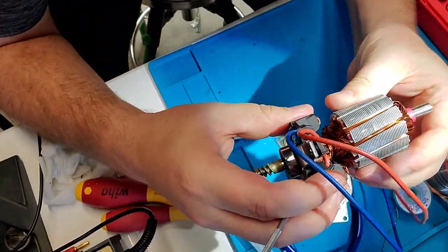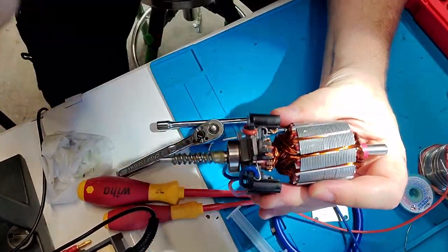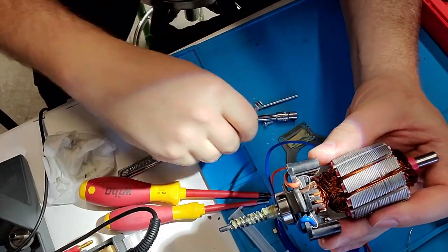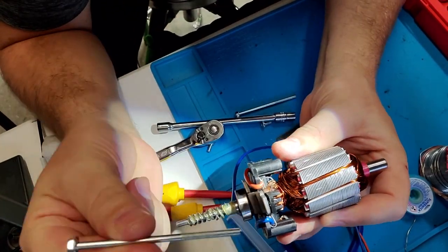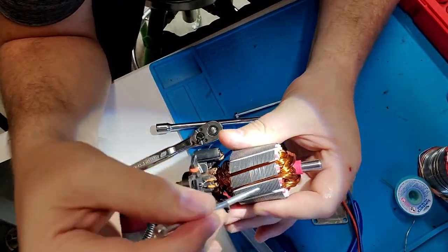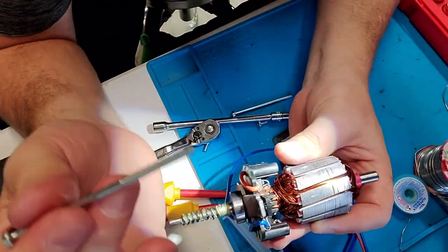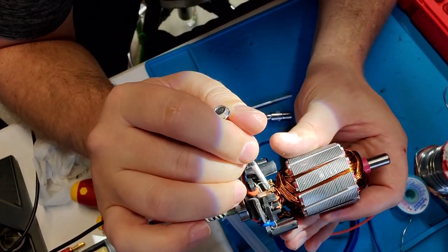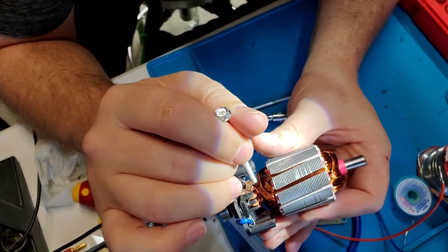One of the other things you should know is these motors, in order to make them better, especially on tools, here, let me see if I can get the light on the situation. So we've got all these copper commutator bars, and the wires are wrapped under a little tab, and the tab is bent over, and that's how you make a connection for each one of these wires on these coils. It's just wrapped underneath the commutation bar, folded over, and now you have an electrical connection. But this is the weak point in brushed DC motors. Not just the brushes, but these commutation bars where the wire connects to them.